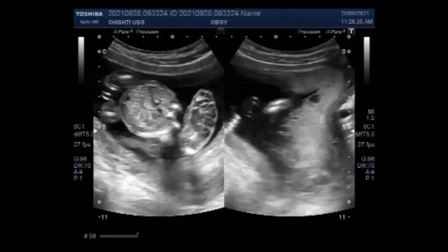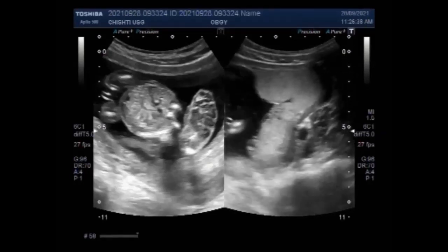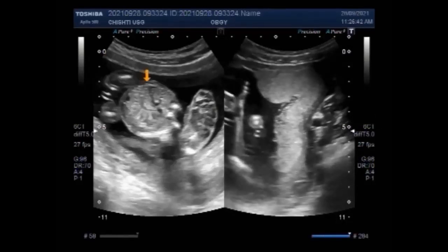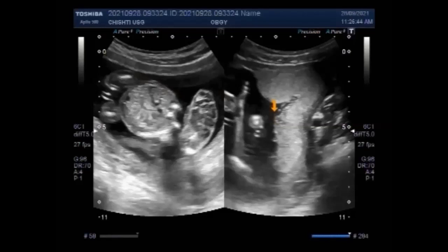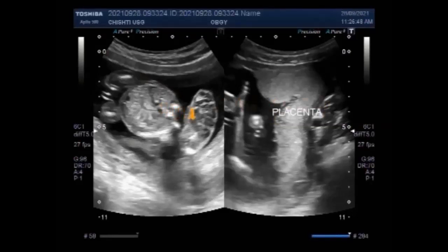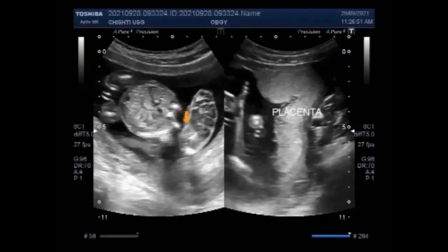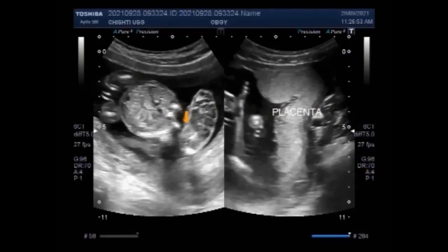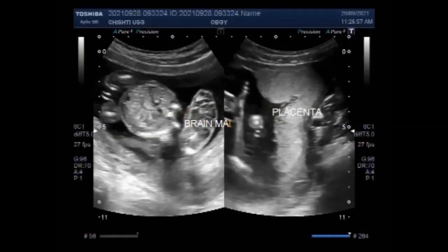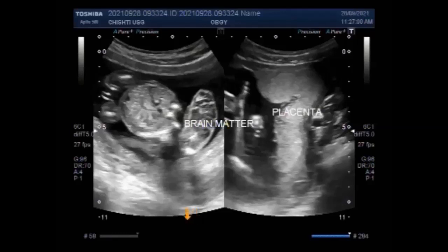Now, placenta is right lateral in this case. This is the brain matter, and now you can see the other video.